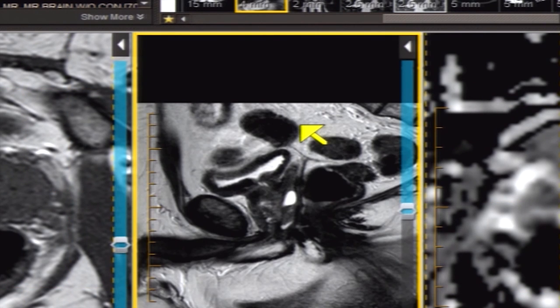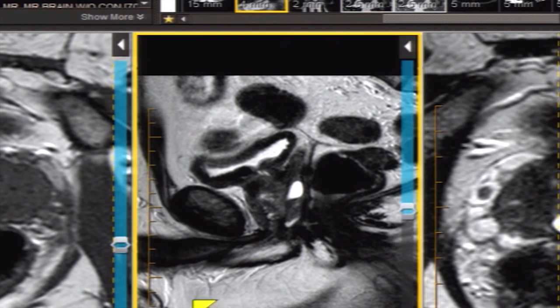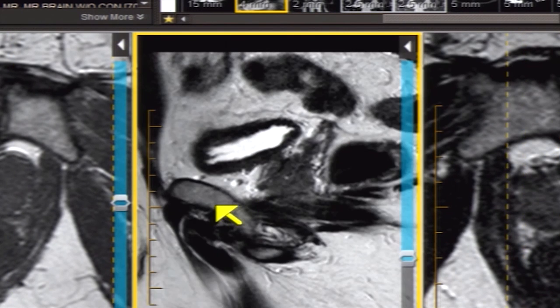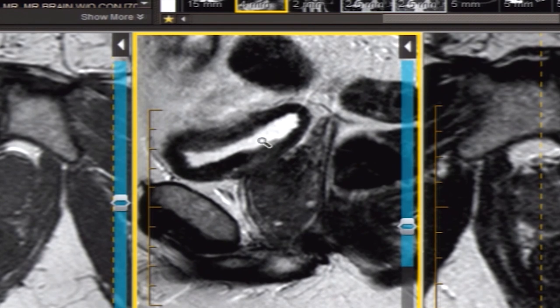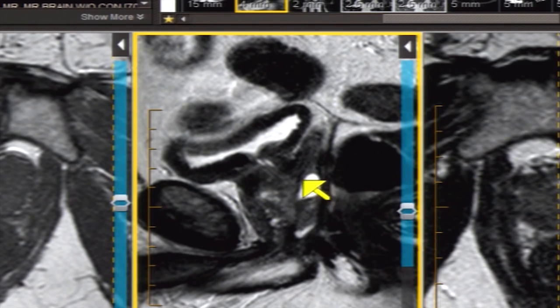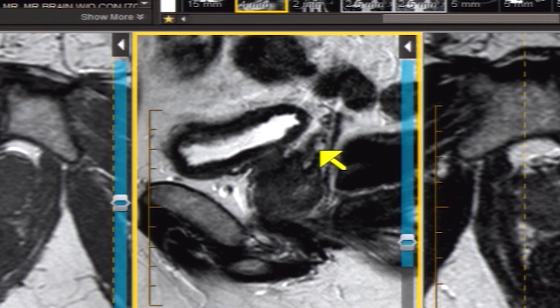Now let's look at the sagittal projection with the T2 image. Here is the symphysis pubis, the bladder, and the prostate gland with the urethra. Following the axis of the urethra, the central region — which is more heterogeneous — contains the central zone and transitional zone. Here are the seminal vesicles converging on the prostate gland on either side.